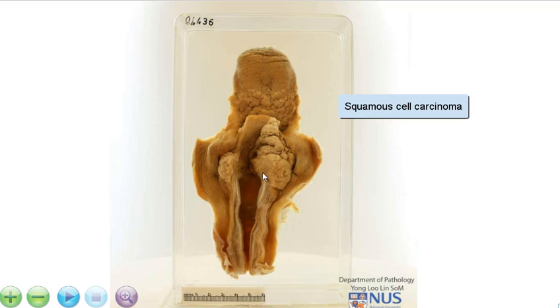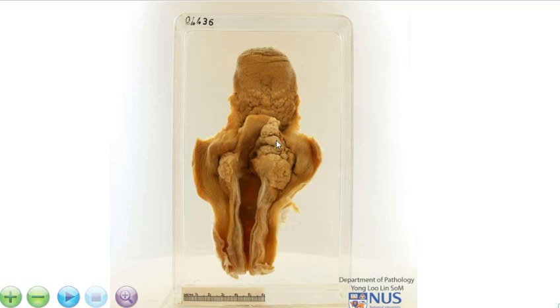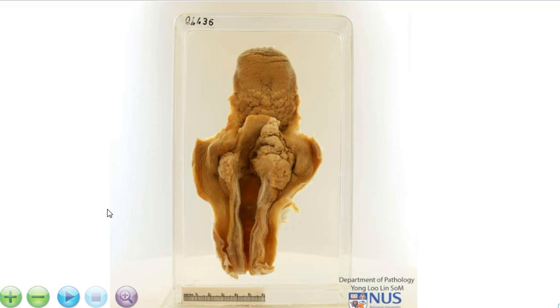So to summarise, we can see a very large laryngeal tumour that appears to be spanning the true vocal cords, the false vocal cords on the right side, and extending upwards into the epiglottis and also extending laterally to the piriform sinus and posteriorly across the midline to the left side. And the histology of this is squamous cell carcinoma.